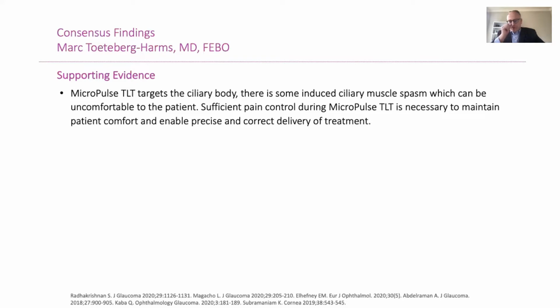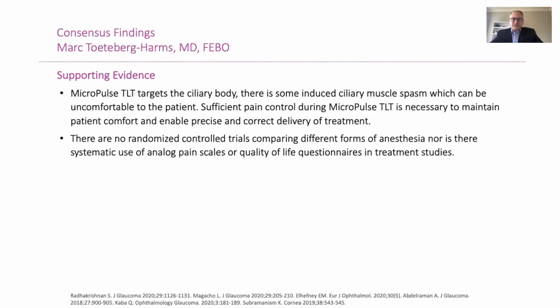So the location should be precise, and you want to do your sweep motion with a constant speed and at a constant correct positioning of the probe in regard to the limbus.